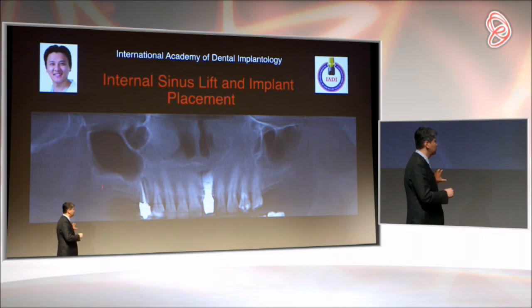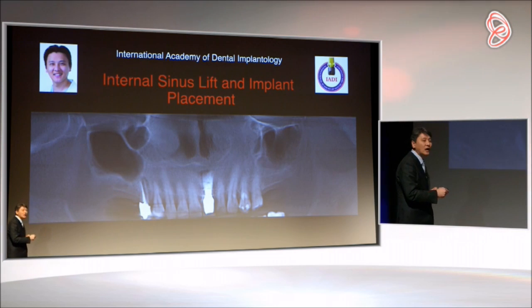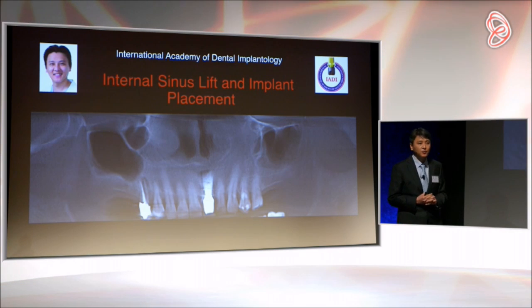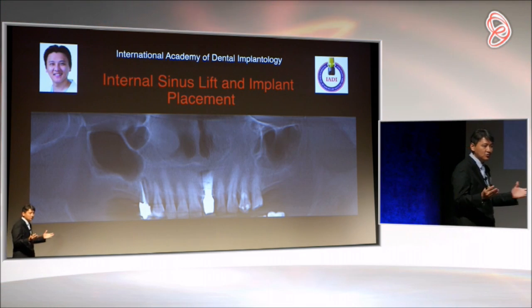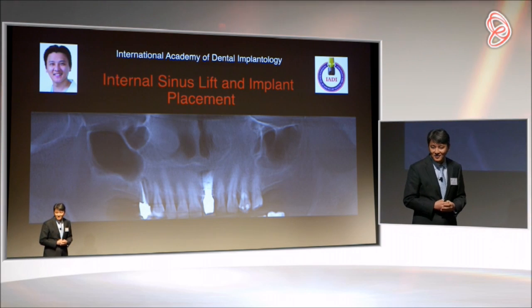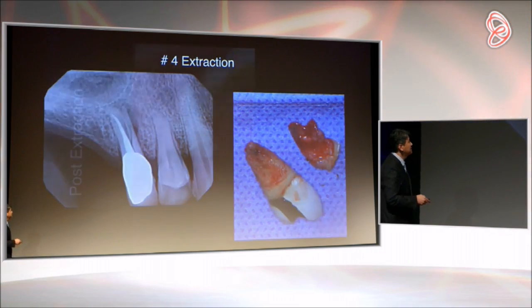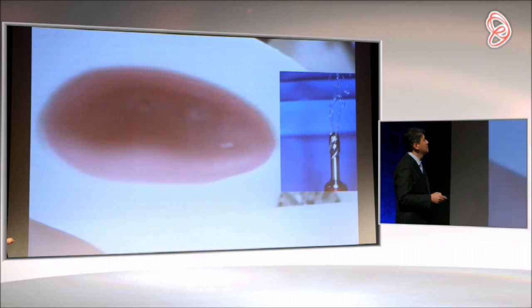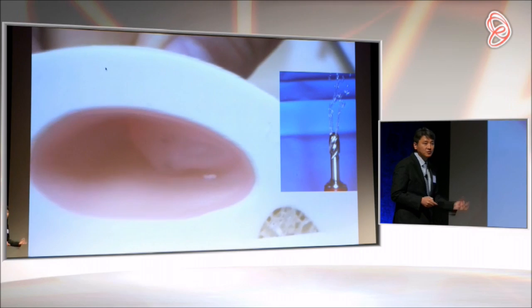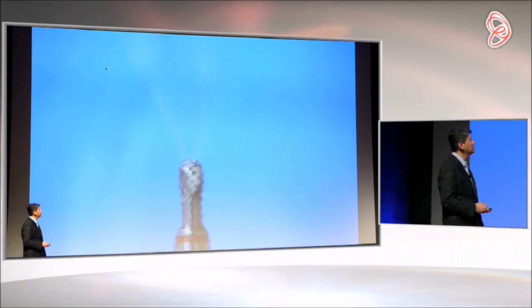This patient walked into my Boston office with a fractured root, and she said, you know, I've been waiting to get more implants, but I've always been scared of doing sinus lift. And I told her, don't worry, because we have the iPhone 7 of sinus lift. So with this technique, I extracted this tooth, and afterwards, because the water protects as we are drilling, it will prevent any unwanted rupture.